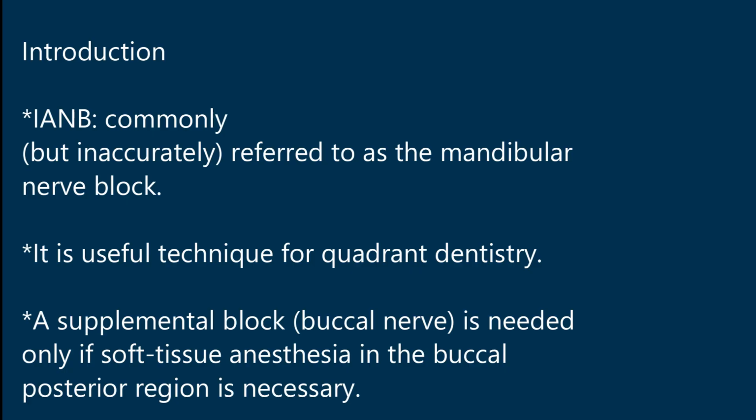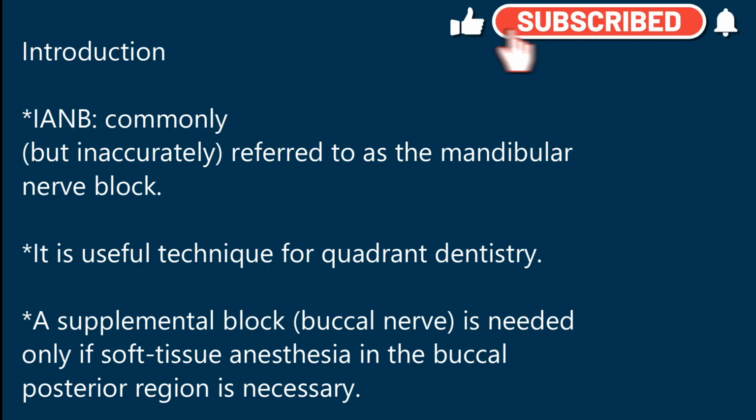Introduction. IANB, commonly but inaccurately referred to as the mandibular nerve block. It is a useful technique for quadrant dentistry. A supplemental block, buccal nerve, is needed only if soft tissue anesthesia in the buccal posterior region is necessary.